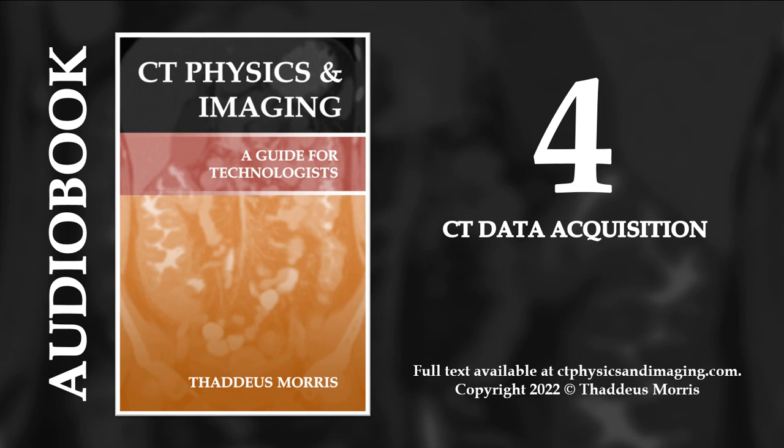Think of the input, or data acquisition, as all of the physical and technical parameters that go into creating the scanned data. Processing, that's reconstruction, is the series of events used to transform this data into useful image information. Finally, this processed data is displayed in the same way as other digital images, as pixels within a matrix that can all be manipulated in various ways. The focus of this chapter is data acquisition and the variety of input variables that go into creating the initial scanned data.